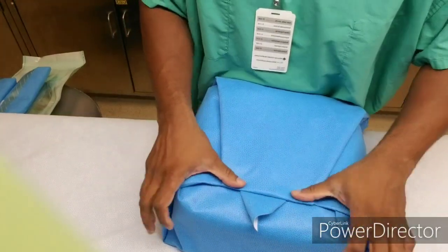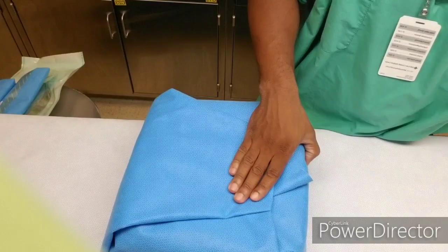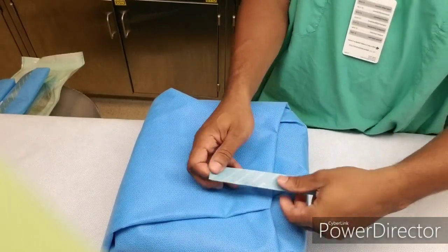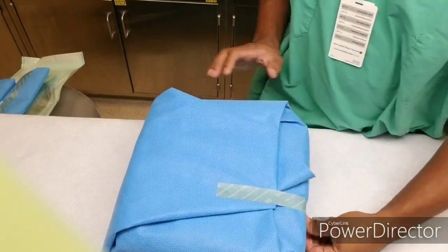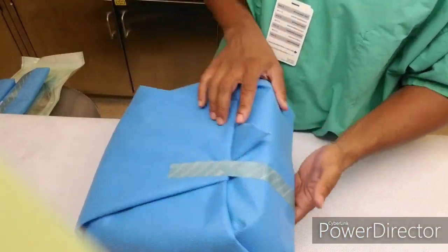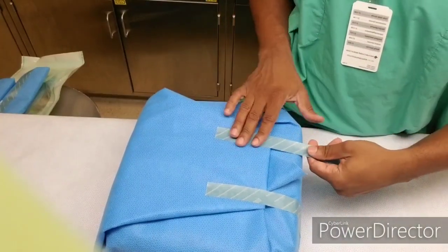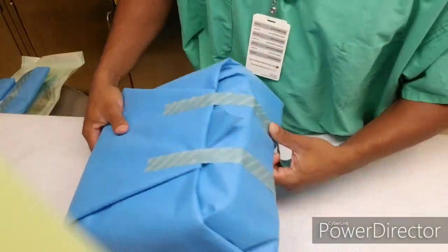Corner protectors are also needed. Also a towel on the bottom and a towel on top — really depending on the hospital, it all varies. This particular hospital is kind of an overkill. They want two towels on the bottom along with corner protectors and a towel on the top.